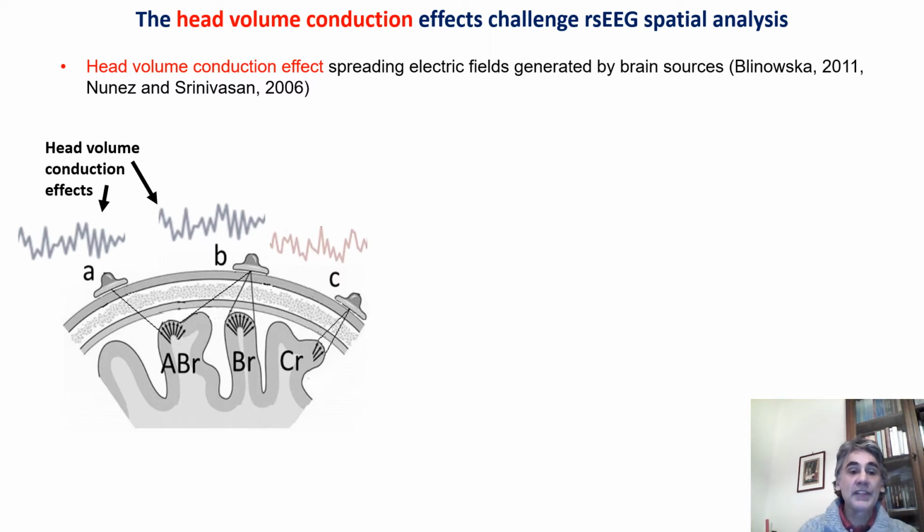It is well known that EEG activity, for example, recorded in electrodes B and A, can be used to study the interdependence of the EEG activity in relation to possible underlying functional connectivity in the cortical areas. However, in this case, the EEG signals recorded in electrodes A and B are mainly due to the same source in the cortical areas.